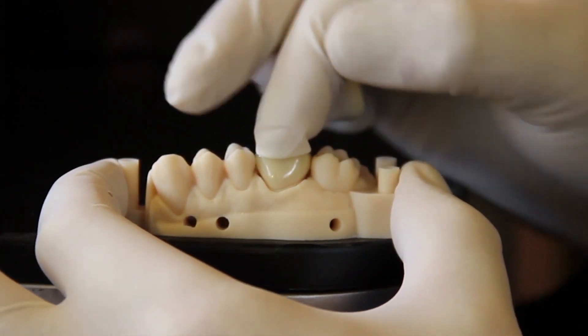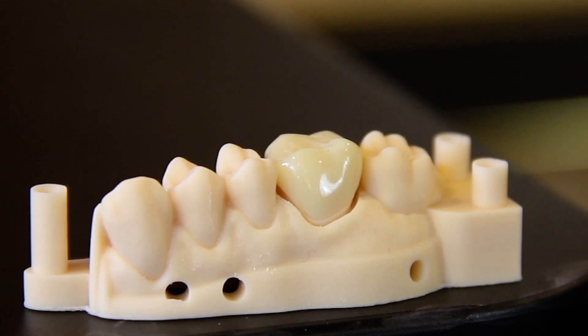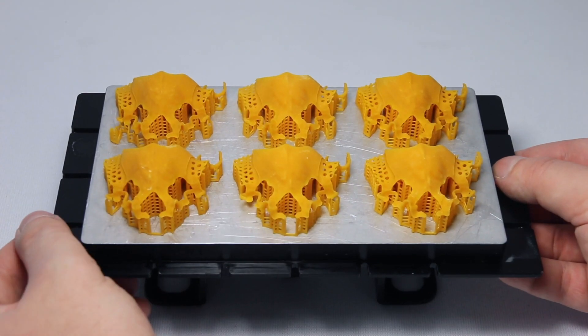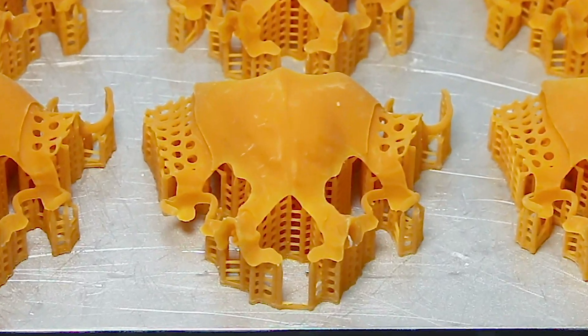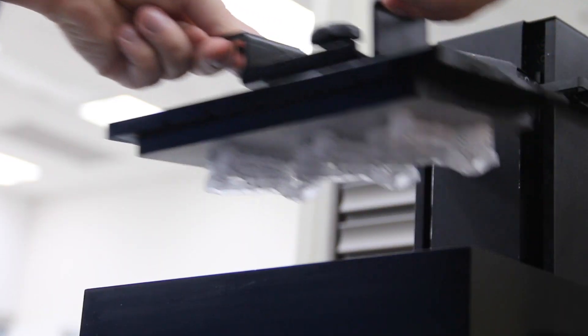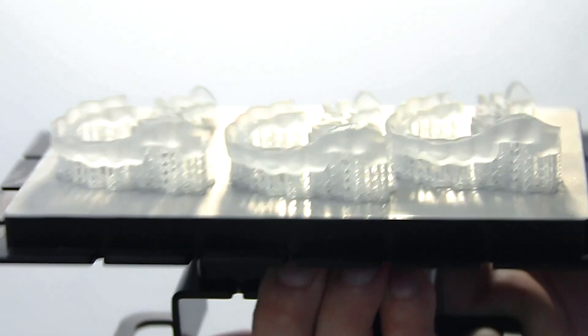18 quads with dyes in 18 minutes, 6 castable partials in less than an hour, as well as indirect bonding trays and surgical guides.